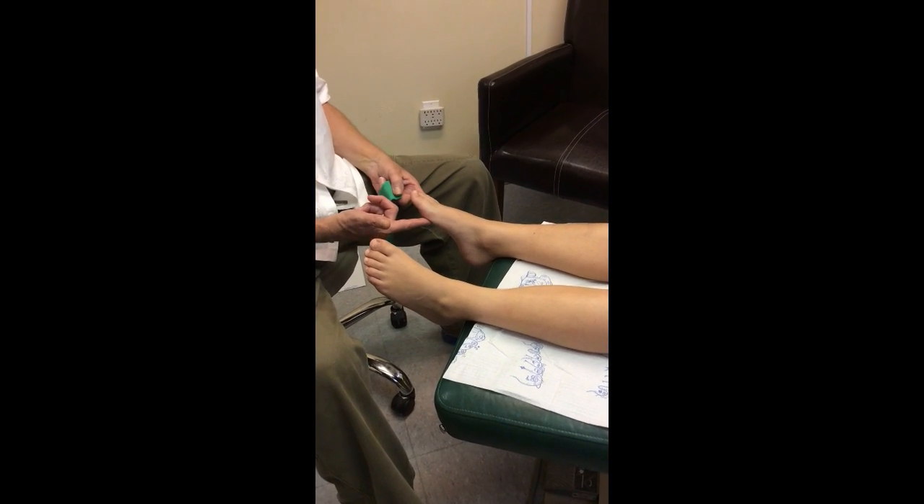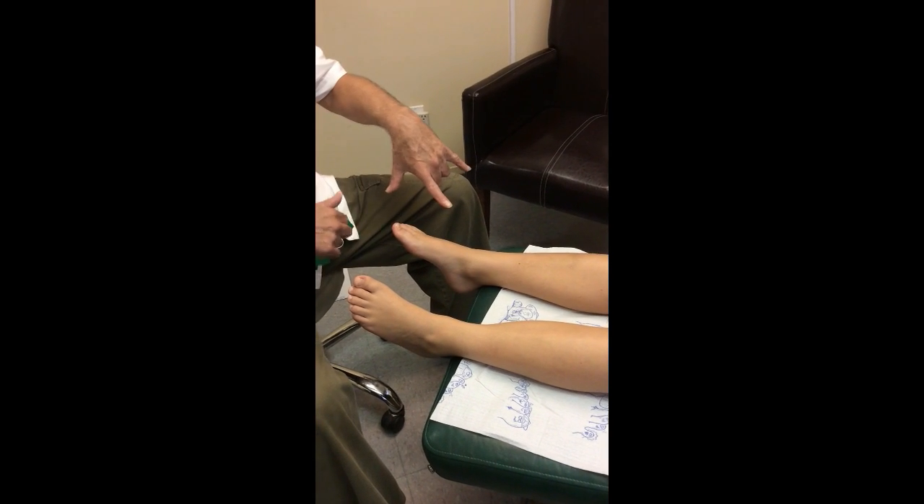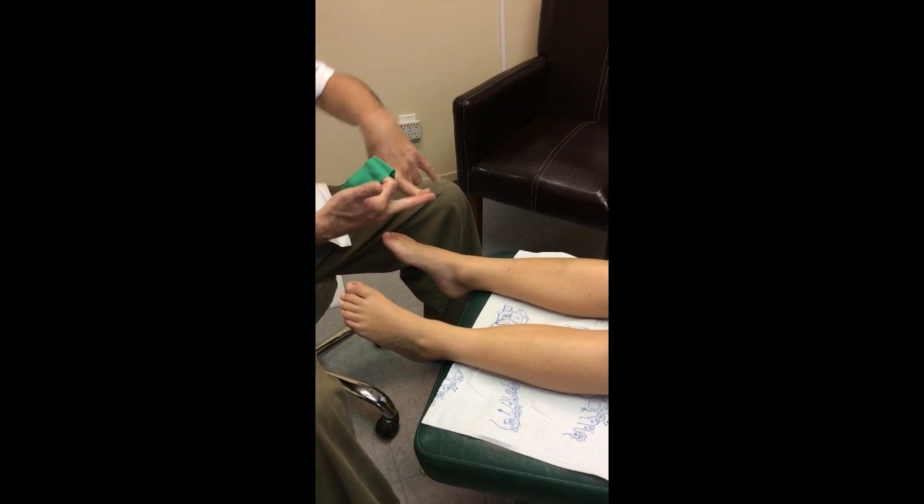So we'd like to fix this. The foot functions like a three-legged table: the first met, fifth met, and heel. On that three-legged table, his pathology is that this leg is lifting up, and the rest of his foot in posture is compensating.